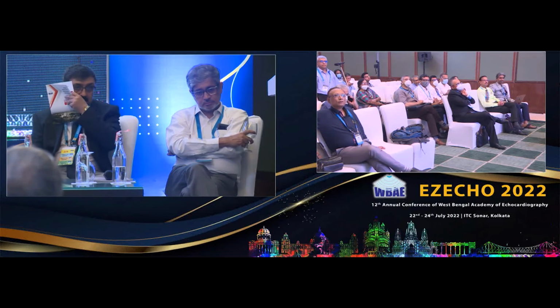That's a good question, sir. There is open gantry MR, and the problem with open gantry MRs is that they're typically of either 1 Tesla or less. So we typically do not get as good a quality of examination with an open gantry MR. I don't have any experience to tell you how many patients who get an open gantry MR actually get good quality images. Do you know of any? You don't. Right, so Dr. Kannan, my colleague, also is not familiar with it. I would basically say that if you are going to do a cardiac MR, it needs to be done on a 1.5 Tesla or a 3 Tesla machine. I would not try to do it on an open gantry MR.